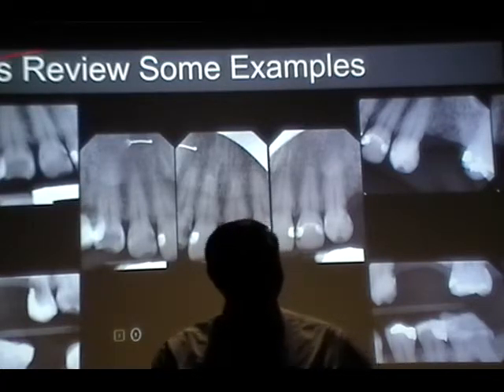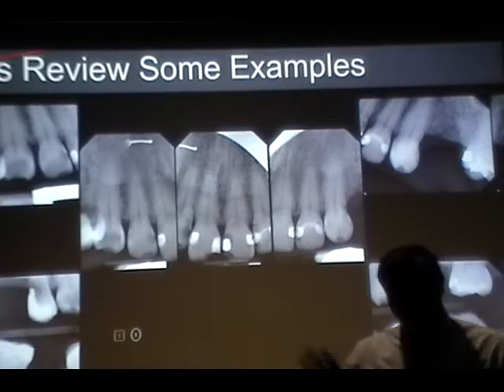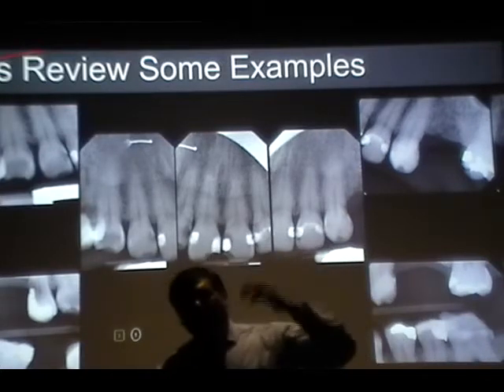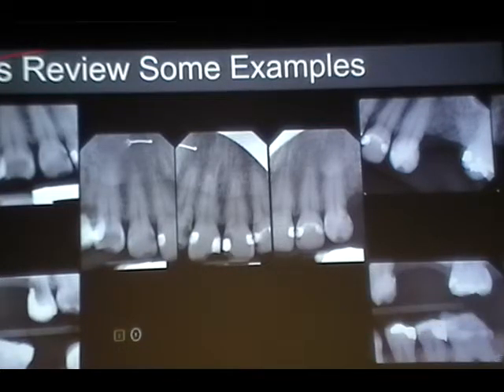Yes. It has those white spots too. I don't remember why those white spots, oh my God. Okay. We are not there yet at looking at the white spots. So let's concentrate on only the images. Like, do we see the apex? Do we see the whole tooth? I see the whole tooth. I see the apex. It has open contact.